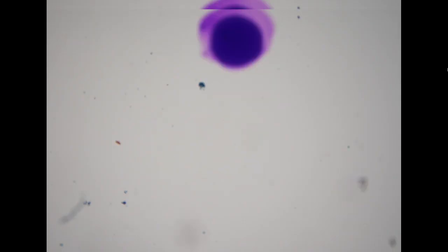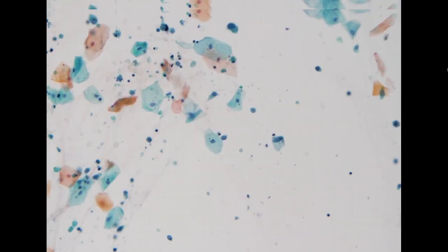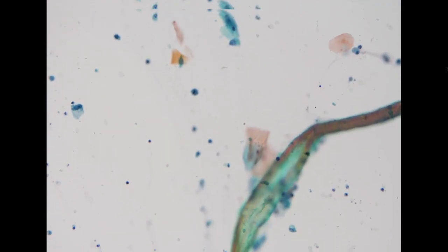So like what we discussed the other day, for upper tract high-grade urothelial carcinoma or carcinoma in situ, in the voided urine specimen, sometimes the cellularity of these atypical cells is very scant, and it can mix with the normal population.